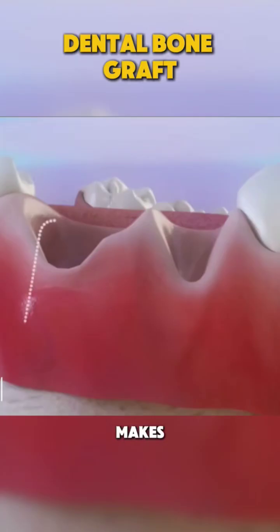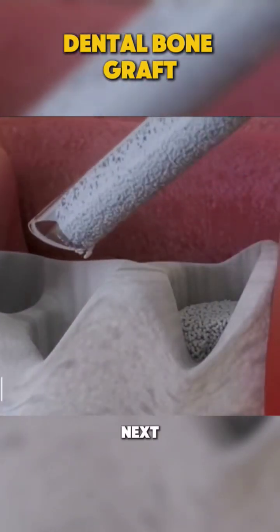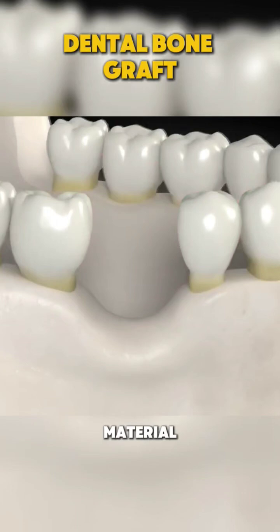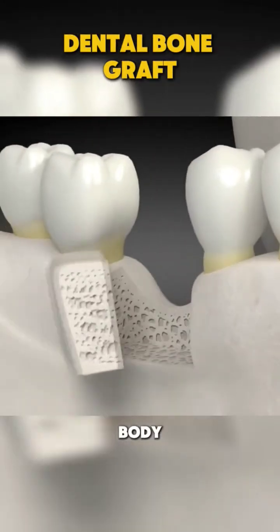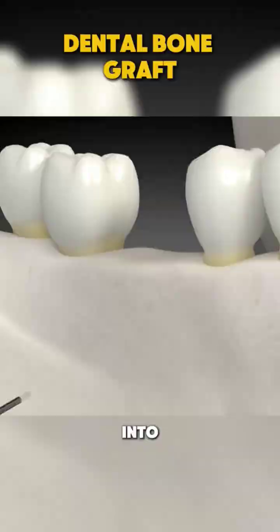First, the dentist makes a small incision. This exposes the underlying bone where the graft will go. Next, bone graft material — which can come from your body, a donor, or synthetic sources — is carefully placed into the area.